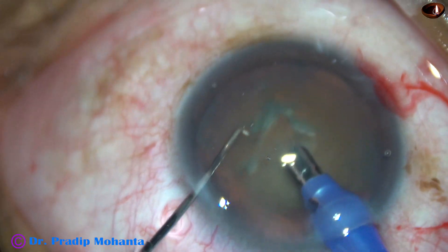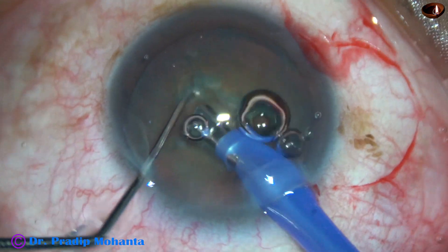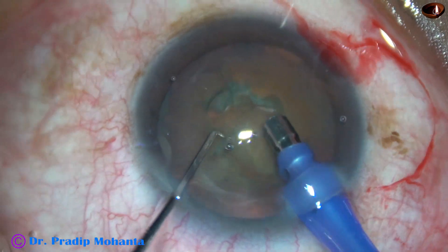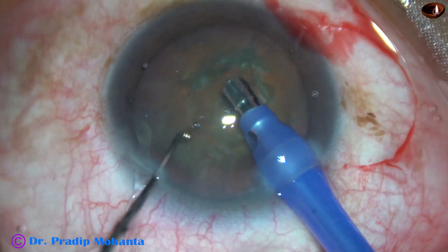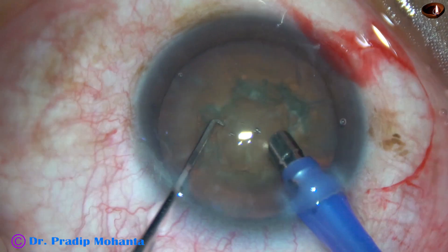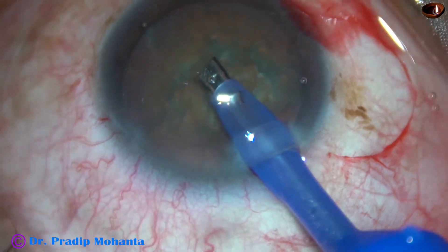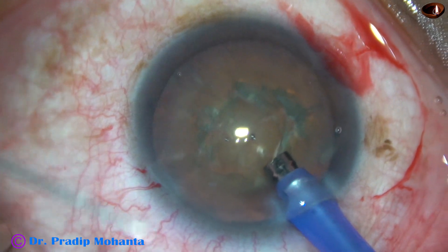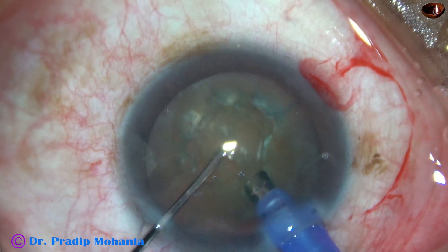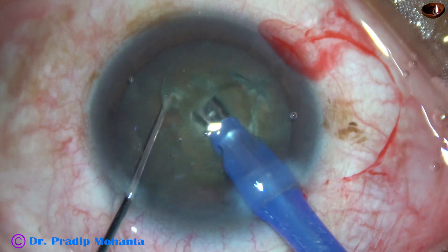Some superficial lens matter is removed. Then the handpiece is turned to make the bevel up. Now I am in sculpt mode. And this is the trench through the center of the nucleus — the first trench.